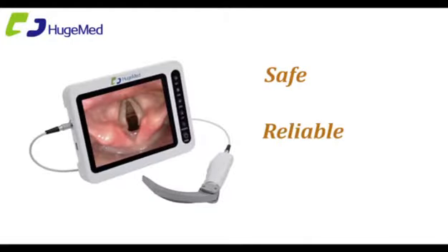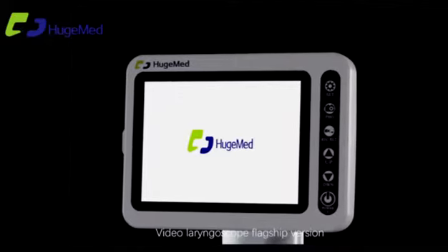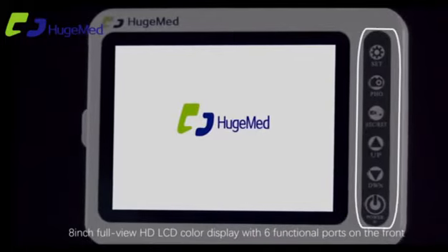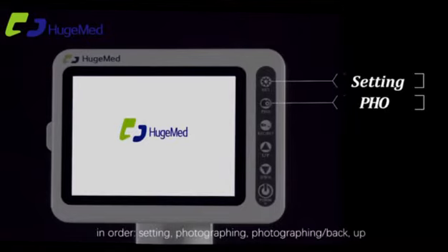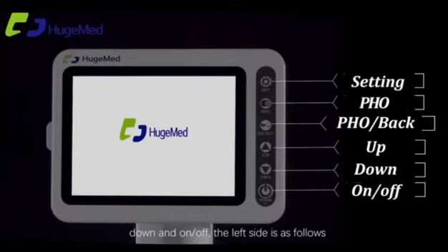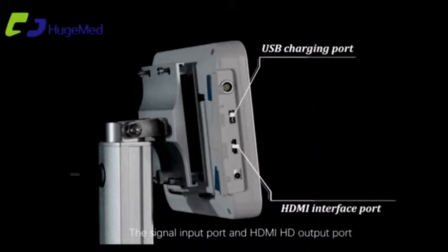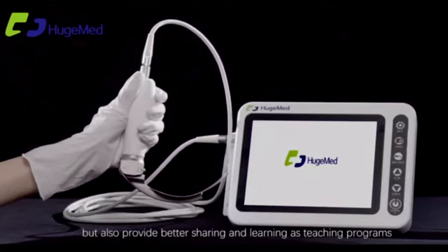Safe, reliable, better vision. The video laryngoscope flagship version features an 8-inch full-view HD LCD color display with six functional ports on the front, including settings, photographing, and power on/off. The left side includes a signal input port and an HDMI HD output port, providing a better visual feel for operation.